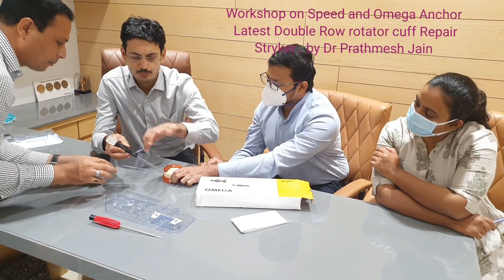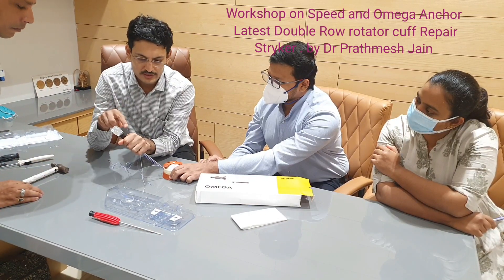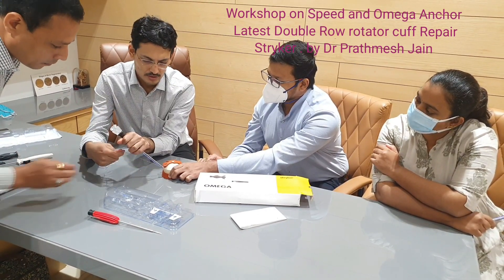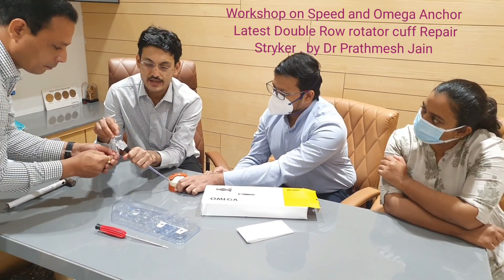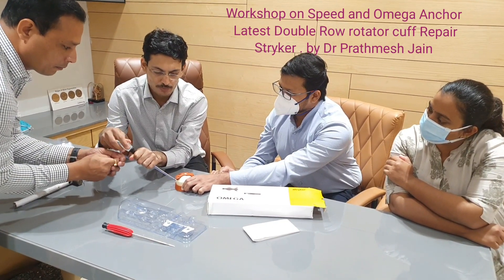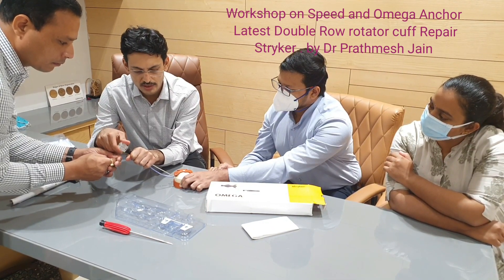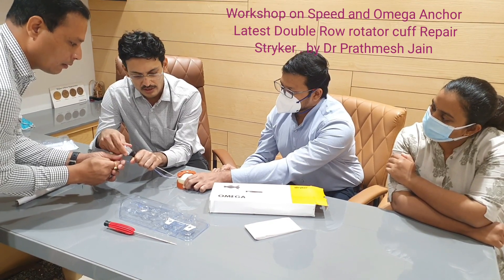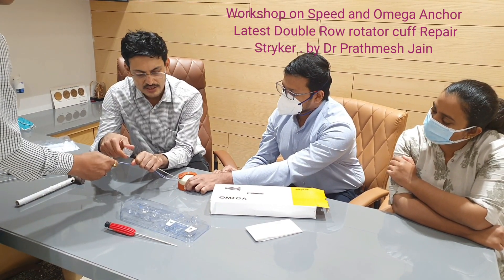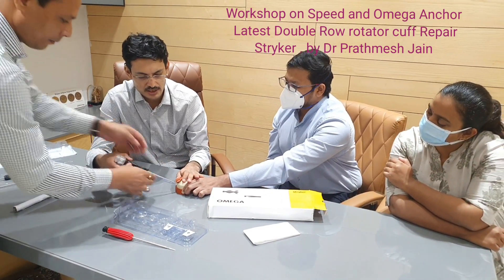Keep the device in a pulled position, hold it with your hand, and rotate the knob to actually insert the anchor onto the lateral row. This gives a very perfect fixation of the lateral row. Once fixation is done, take the inserter out.